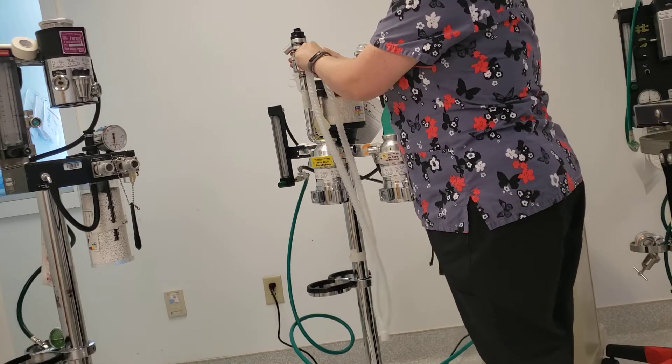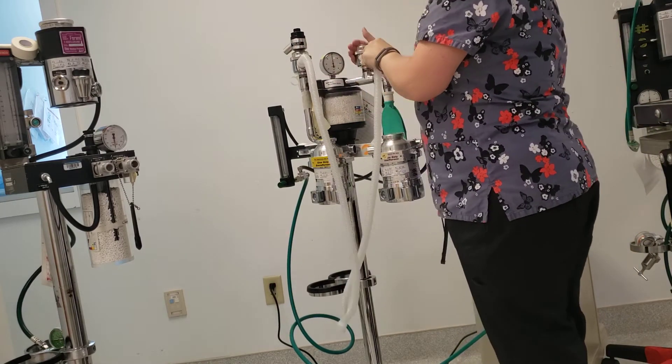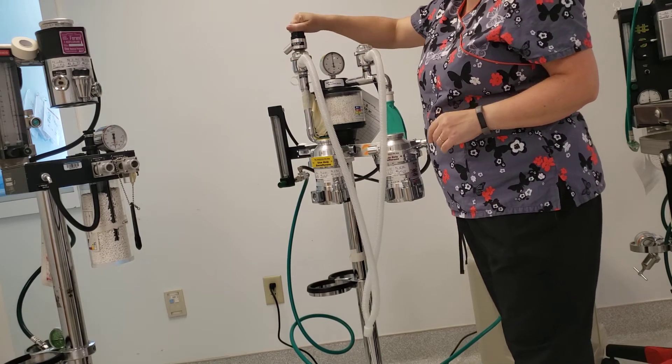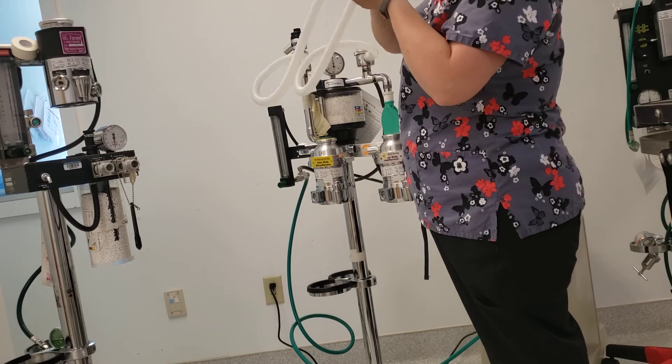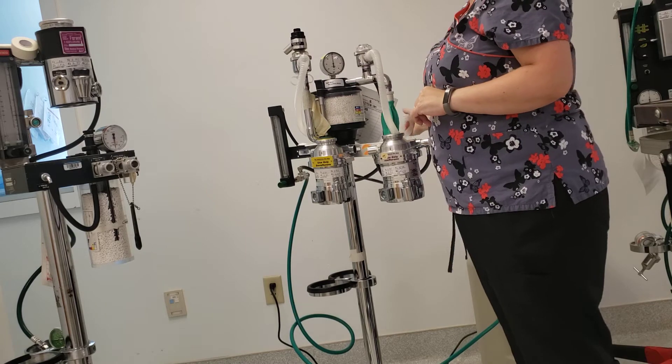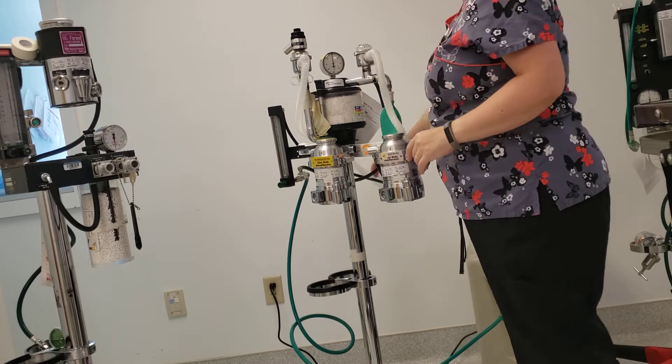Your exhalation and your inhalation ports for your breathing tubes are here and here. Your exhalation is usually attached to your pop-off valve. I'm going to flip these tubes around to the back just so that you can actually see what's going on here.